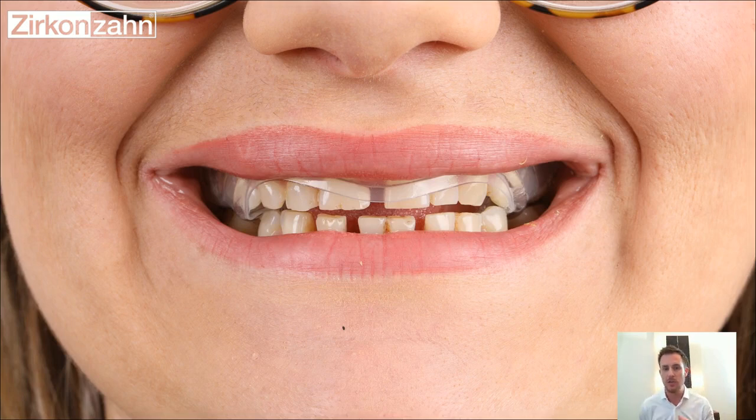So the idea here is also to start with a snap-on smile. A lot of people ask me how to capture the correct bite, and we have a certain workflow with an instrument called equalizer to deprogram the muscles of the patient so they no longer find their original occlusion. We deprogram everything with this equalizer to find the correct height and the correct position of the lower jaw.